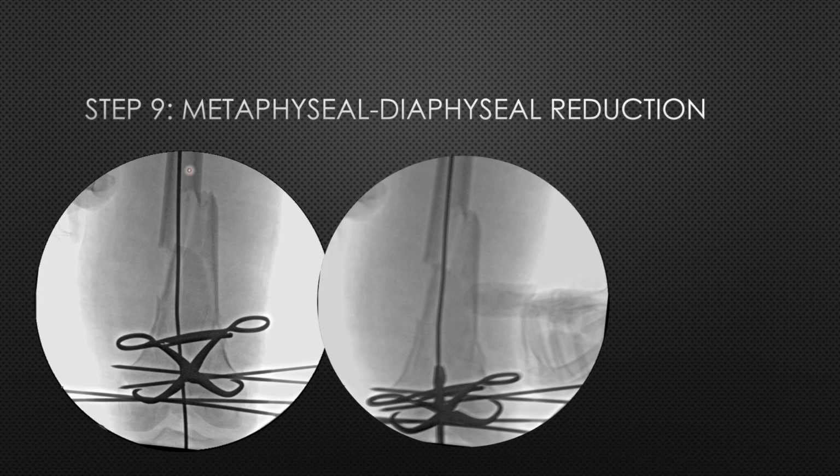So again, I told you we have to see the alignment of the shaft with the terminal part, or you can say the articular part or the condylar part. We need not be worried about this. So here the alignment appears to be satisfactory. The terminal part of the condyles is in slight valgus, which is normally there in the distal femur.